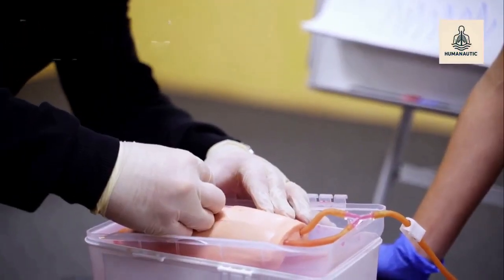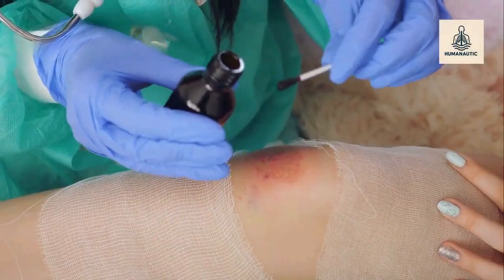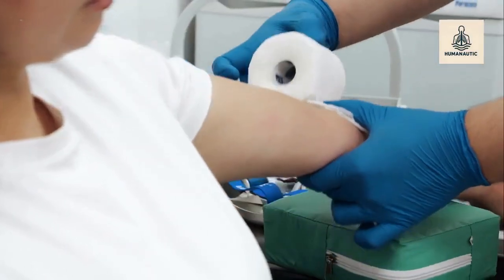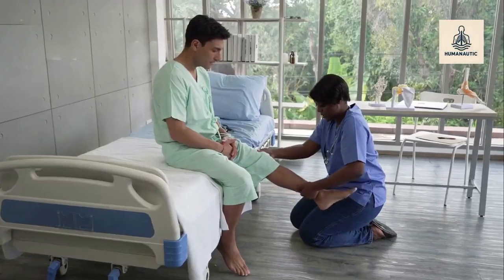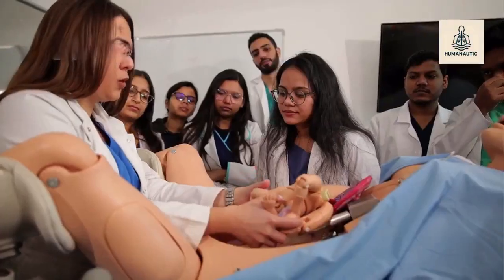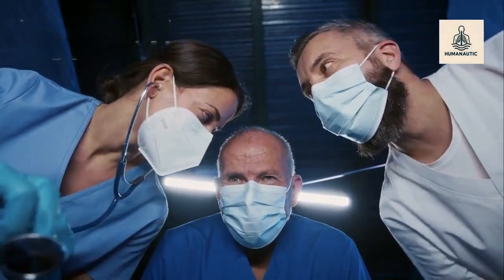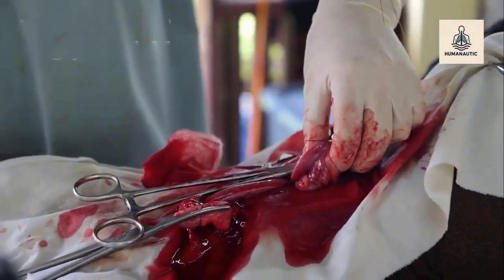Step 6, wound management. Decide on secondary healing, delayed closure, or skin grafting. Apply an appropriate dressing. Complications. Possible complications include bleeding, pain, damage to healthy tissue, and infection if asepsis is poor. Remember, a wound that is not clean cannot heal.